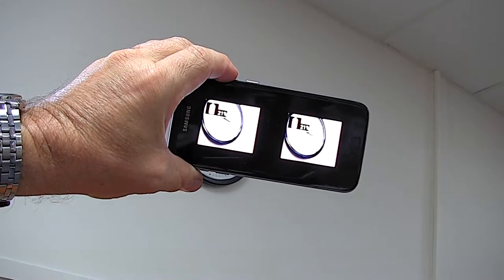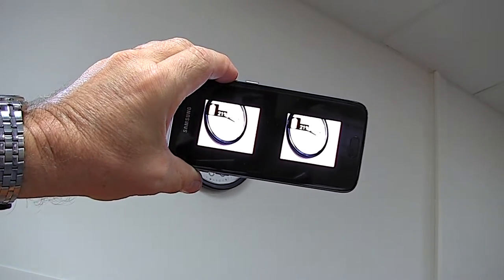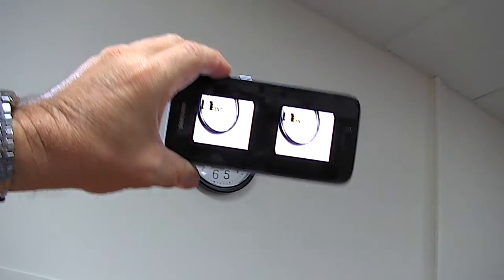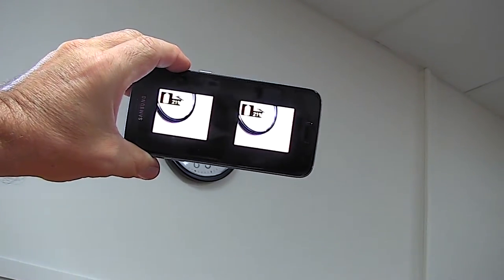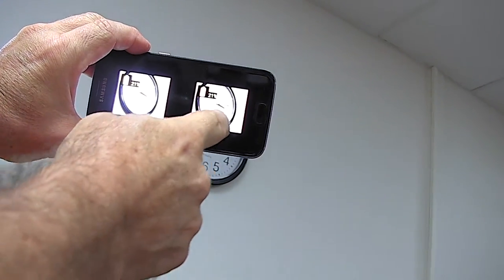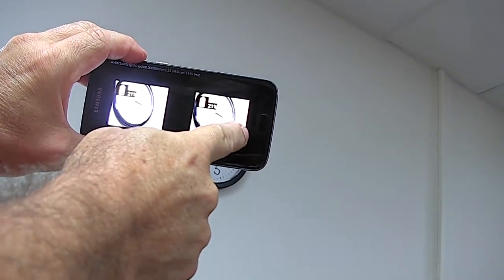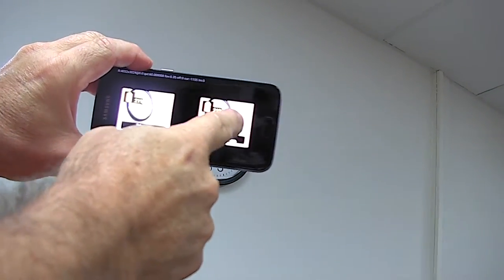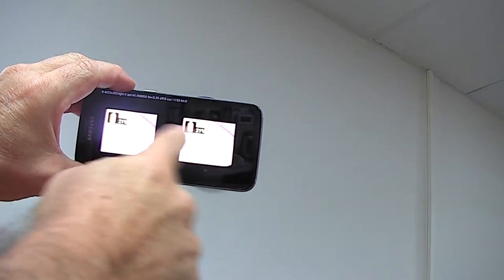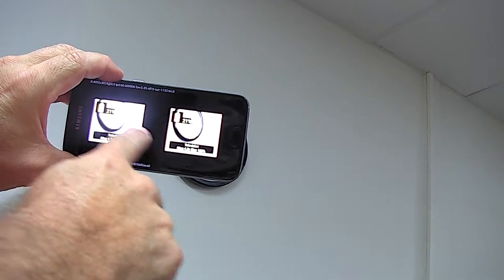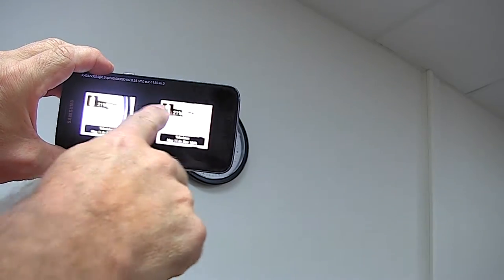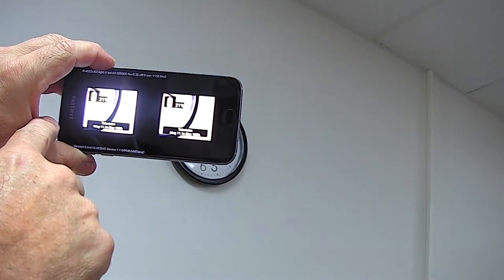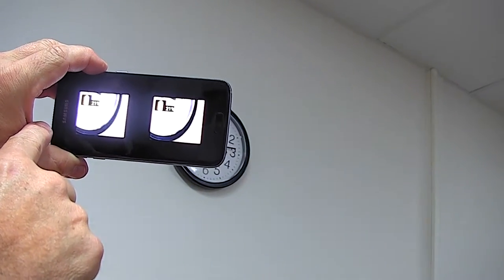They can be zoomed by swiping on the side of the VR headset. What I have to do here, doing this manually, is zoom by swiping right to left or left to right. Here we can get up to 12 times zoom.